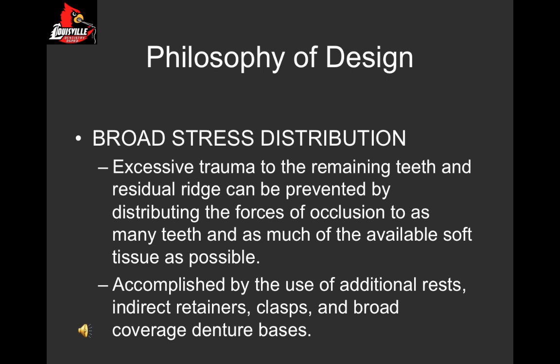The last philosophy of design is for broad stress distribution. Excessive trauma to remaining teeth and residual ridges can be prevented by distributing the forces of occlusion to as many teeth and as much of the available soft tissue as possible. This is accomplished by the use of additional rests, indirect retainers, clasps, and broad coverage of the denture bases and palatal major connector.